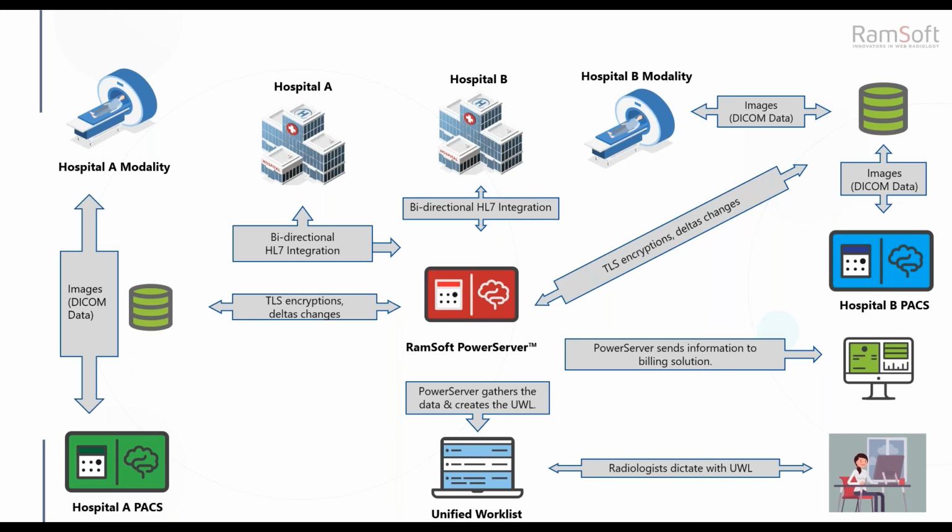Now, while it's always desired that your radiologists view and report in your centralized system, occasionally they open a study in the hospital system, right? I mean, that's what they've been used to for years. And somebody says, hey, can you look at this? Boom, they open it up, and next thing you know, they're reading a case in the hospital system. No problem.